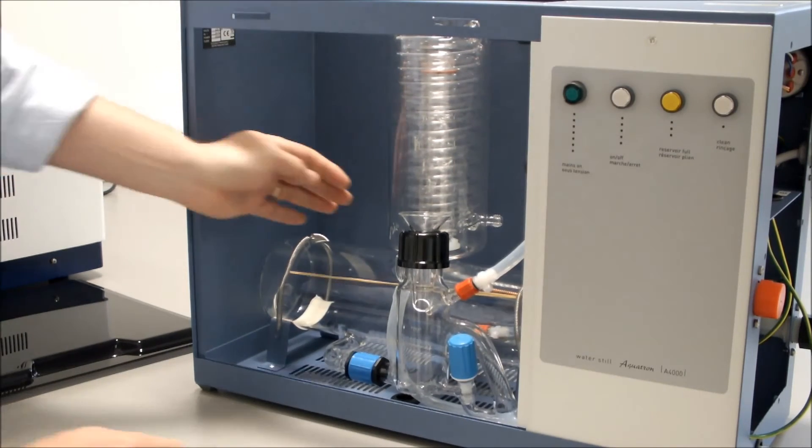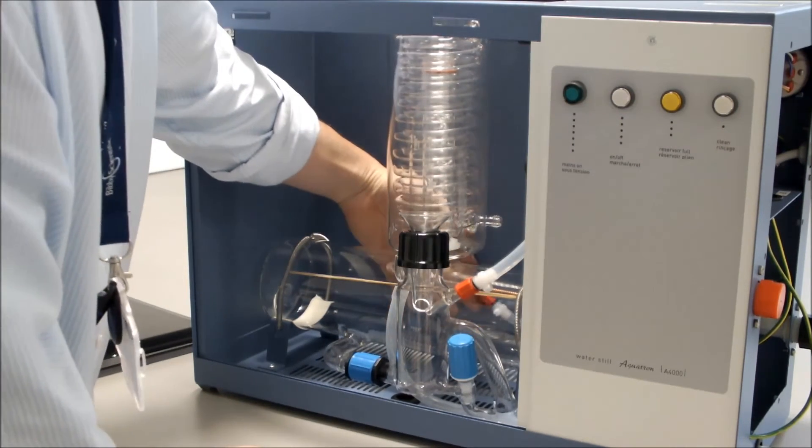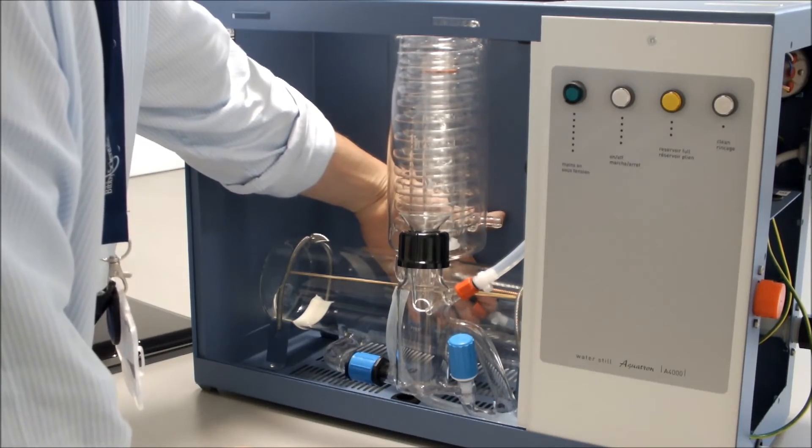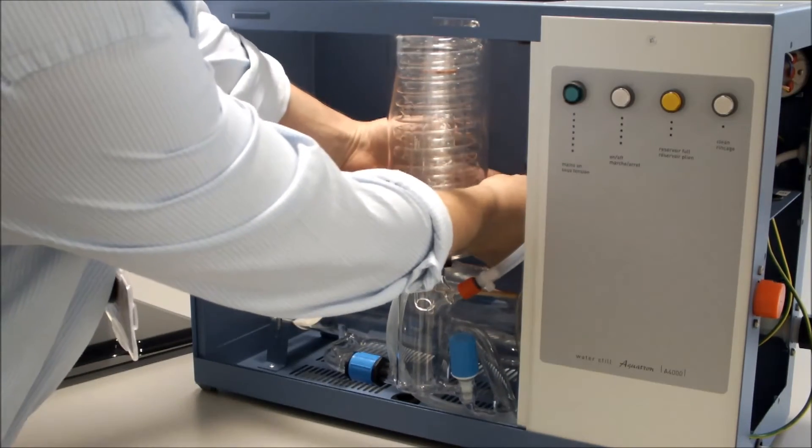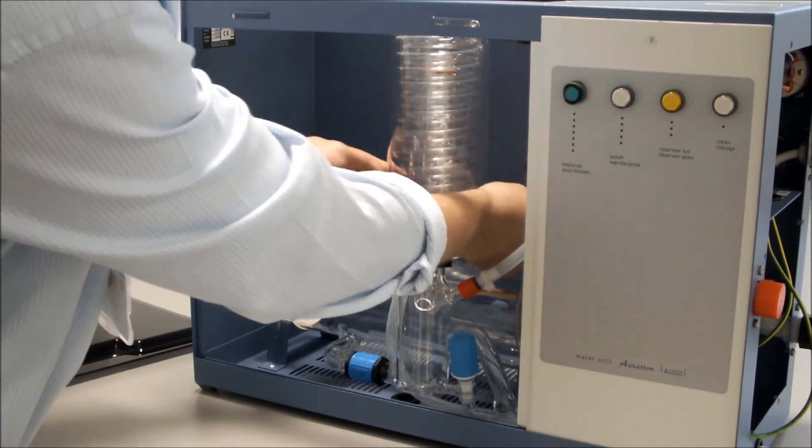The next thing to do is to connect our water flow level sensor, which is at the back, and we connect that to the bottom of the condenser.